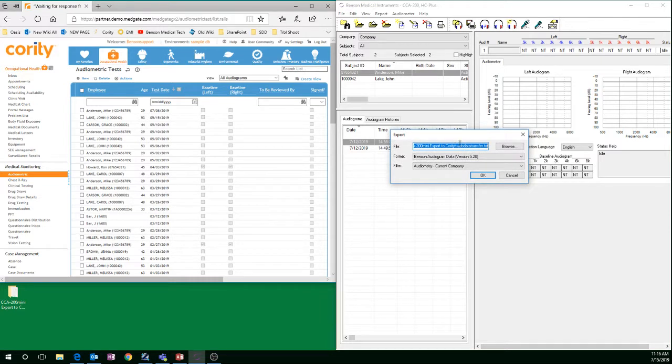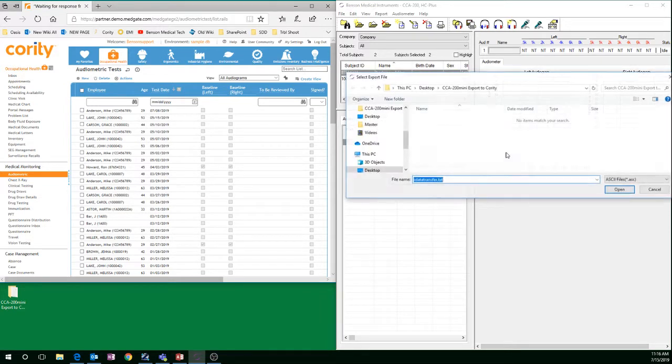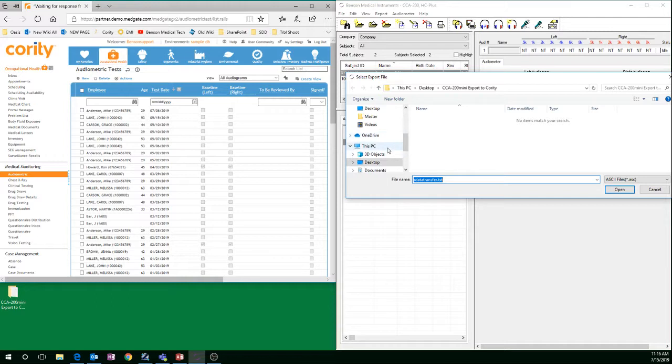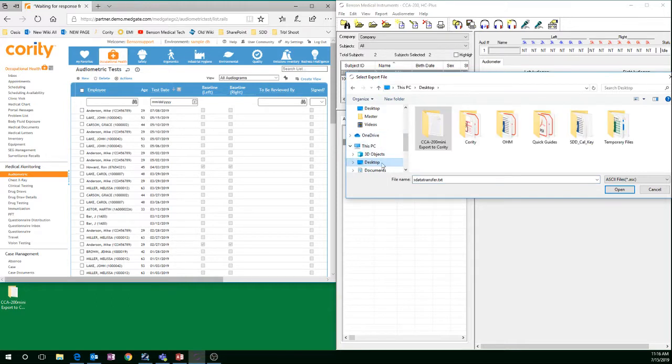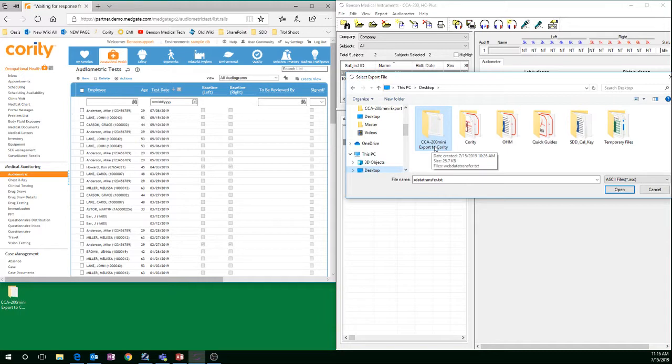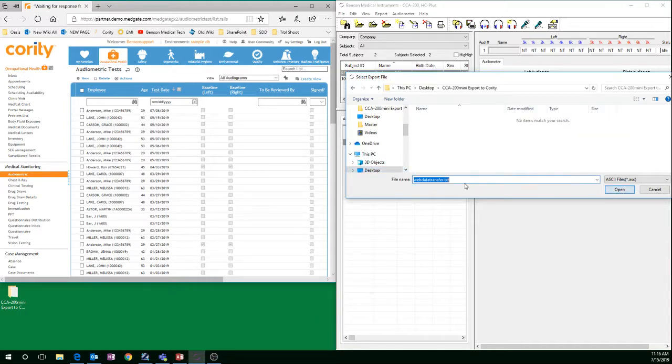These settings will only need to be set up once. Go to Browse, create a folder wherever you would like. For the sake of this video, I created a folder on my desktop called CCA 200mini Export to Cority.